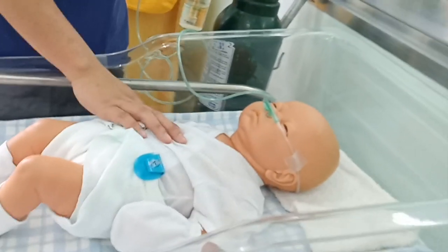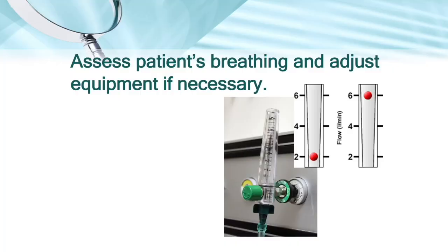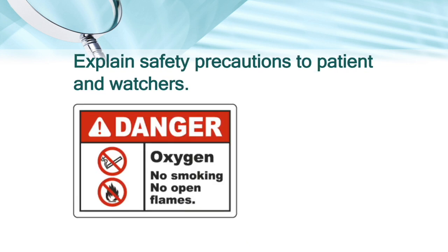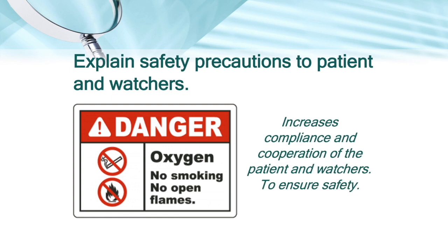Assess patient's breathing and adjust equipment if necessary. This ensures delivery of prescribed oxygen therapy in conjunction with a specific cannula or mask. Explain safety precautions to patient and watchers. This increases compliance and cooperation of the patient and watchers to ensure safety.